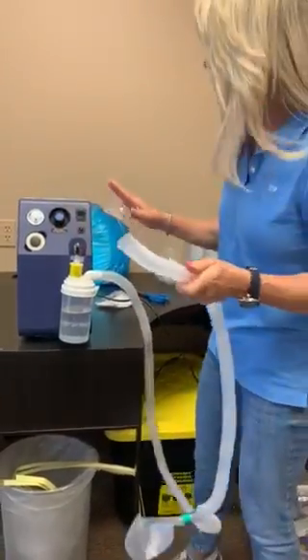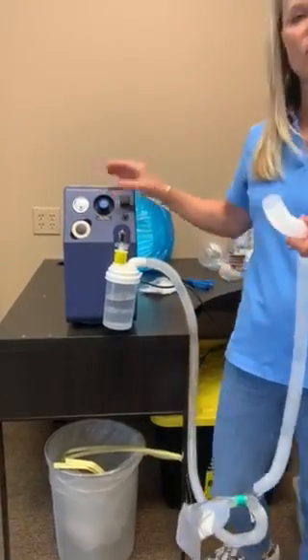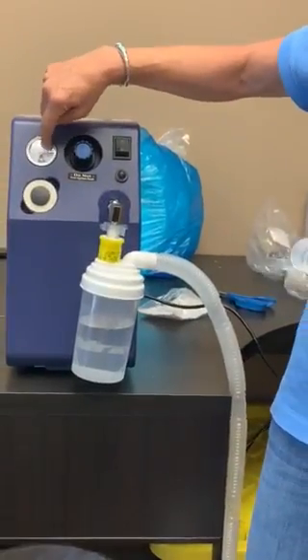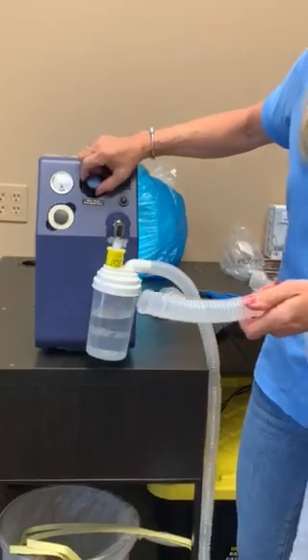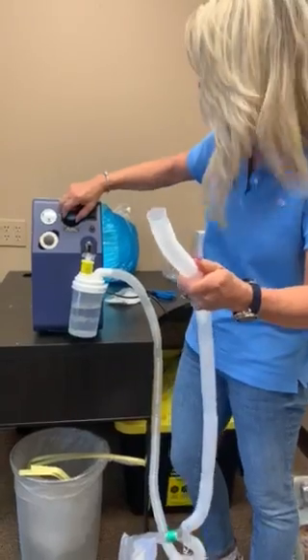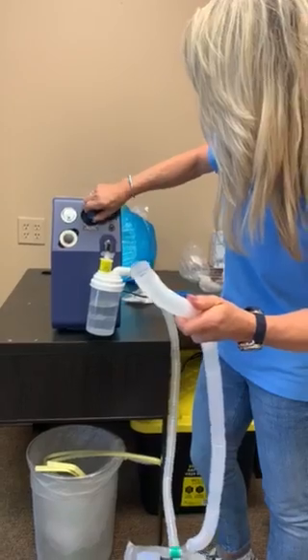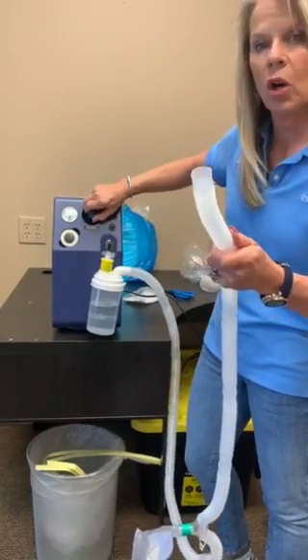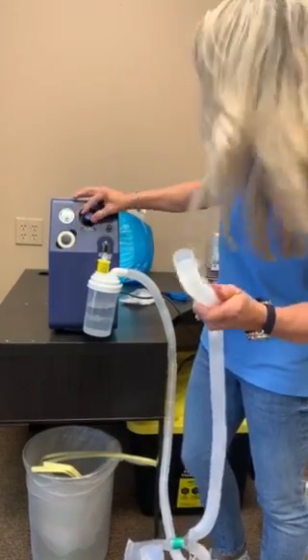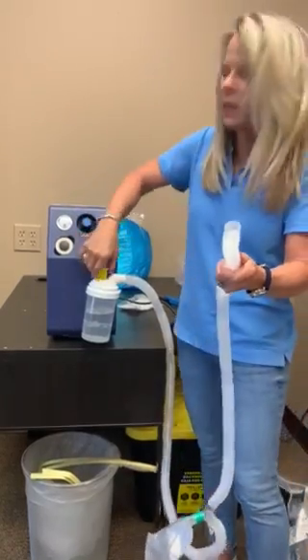So let's go over how to operate this machine. You turn it on. The mist is controlled by two things — it's controlled by the manometer here. Again, we set it between 25 and 35. You can see that if I pull the knob out, I can turn the dial and it's going to get stronger. Once I set it how I like it, I push the knob in and that locks it into place.